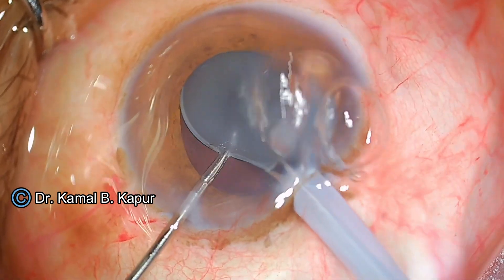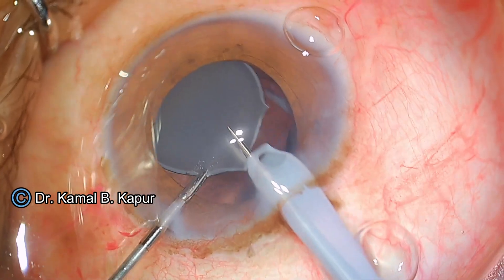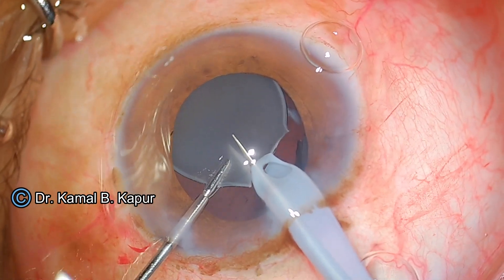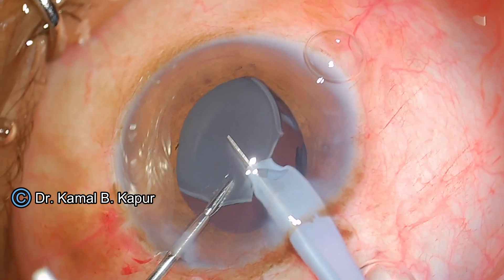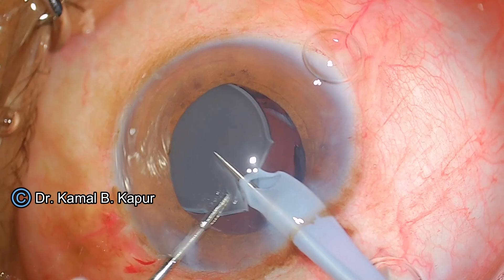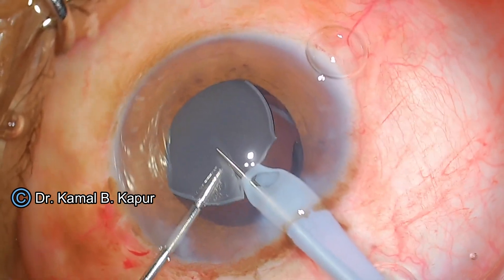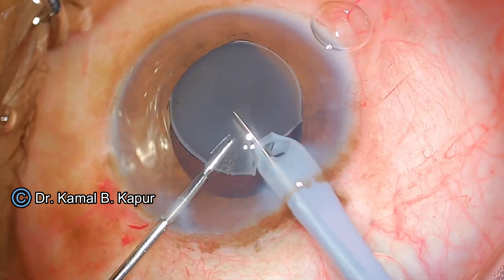My left hand will keep grasping, re-grasping, and re-grasping the IOL every time I need to apply power. I am having some difficulty while cutting, so I asked my technician to increase the power to 60%.